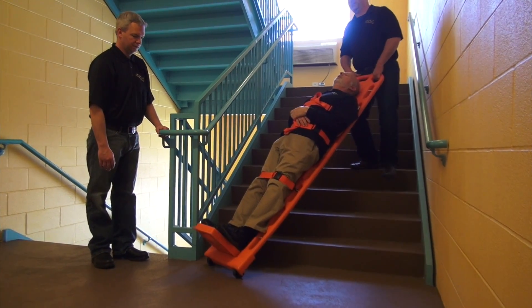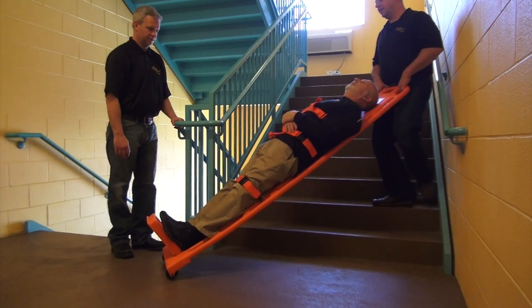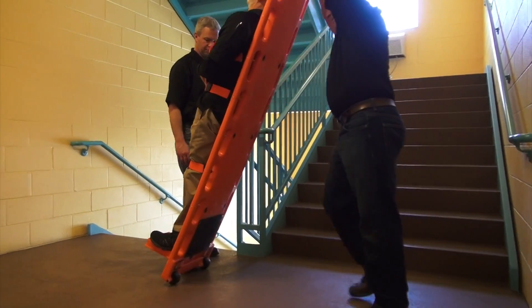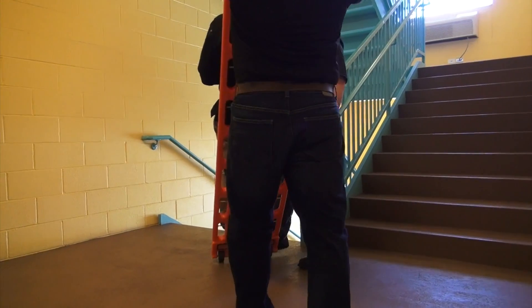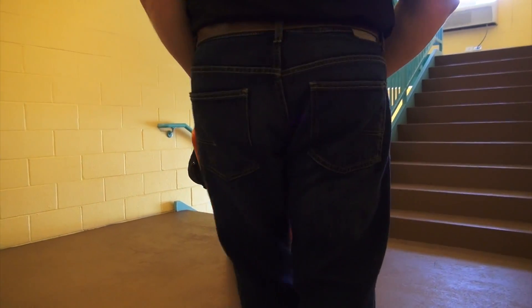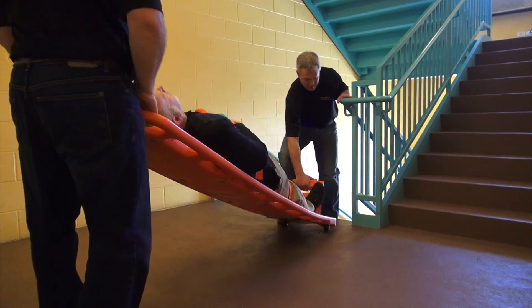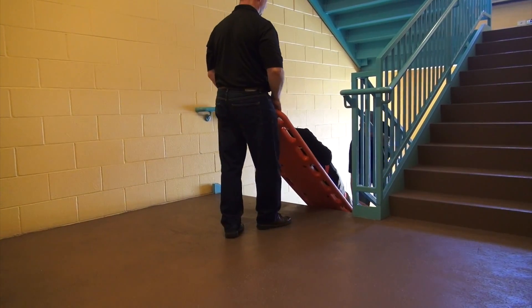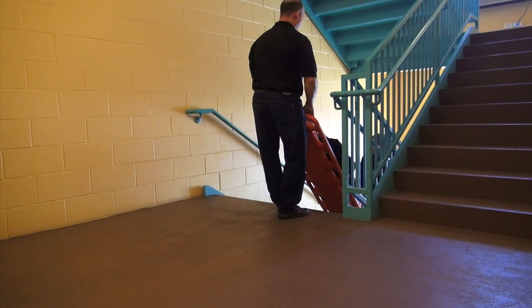Before beginning the cornering process, make sure the pivot wheel is in the right position. If you are on a stair landing, do not begin the cornering process until the pivot wheel is able to go down the next staircase. If you corner too soon, the patient will be in line with the railing rather than the stairs.